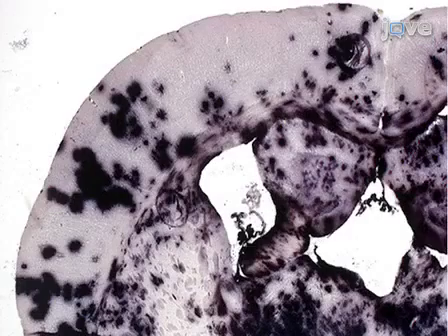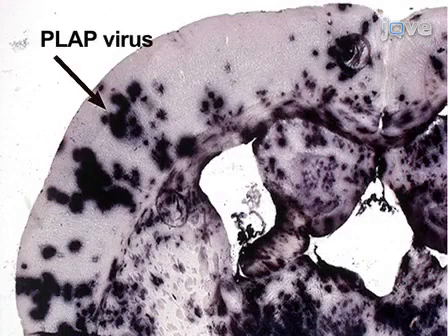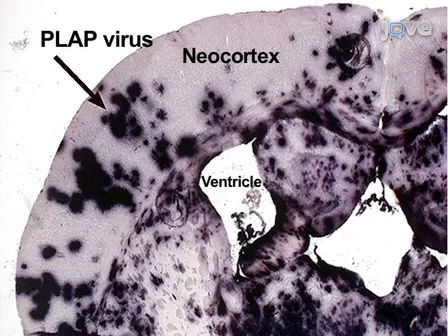In this image, an embryo injected with a PLAP-expressing virus shows PLAP-positive virally infected cells within the developing brain several weeks post-infection. Reporter expression allows examination of cell morphology and cell position, as well as a clonal analysis.